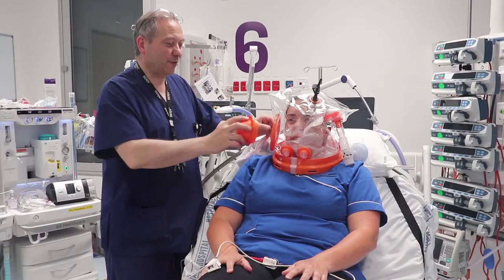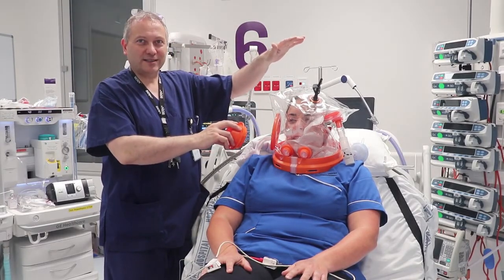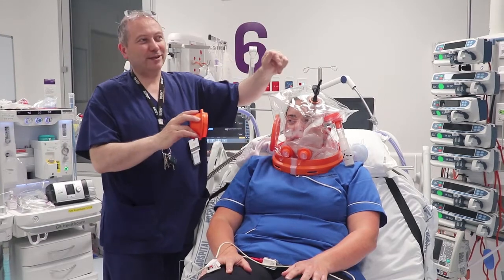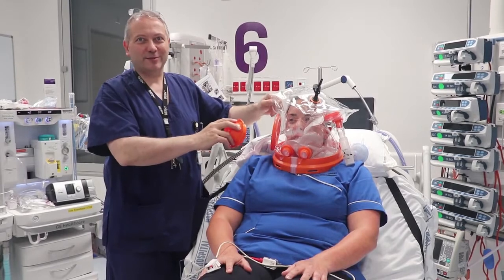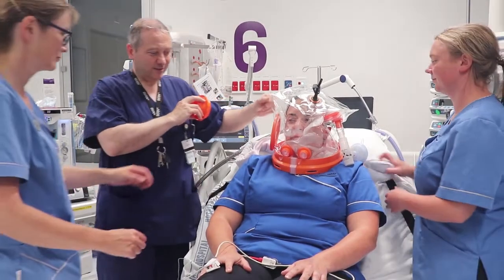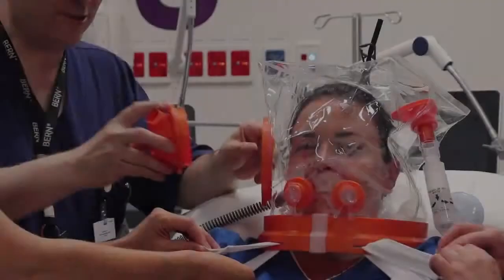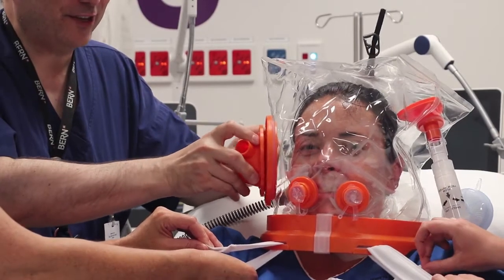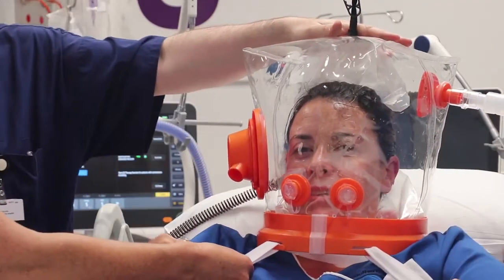Next we apply the free breathe valve. When we do this the helmet will fill with gas, and it's important that Louise and Sarah are here to apply the straps — otherwise the helmet will rise up. We'll apply the free breathe valve and the helmet will inflate; we may need to adjust the straps.